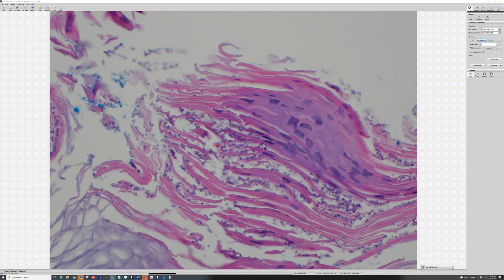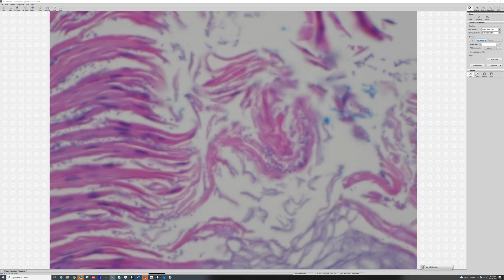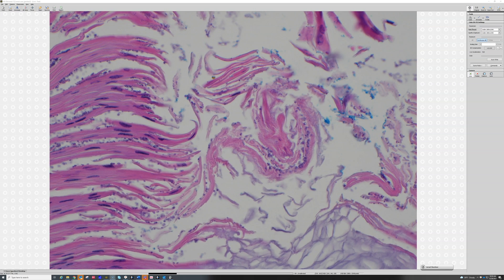The only time these produce an abnormality is when they start overgrowing and produce hyphae — in that case they have the so-called spaghetti and meatballs appearance, with yeast plus elongated hyphae. That means they're overgrowing and producing a condition called tinea versicolor, or pityriasis versicolor, which is probably a better name since these are not true tinea dermatophyte fungi. People get patches on their skin that are either hypo- or hyperpigmented, usually relatively asymptomatic but a cosmetic problem.